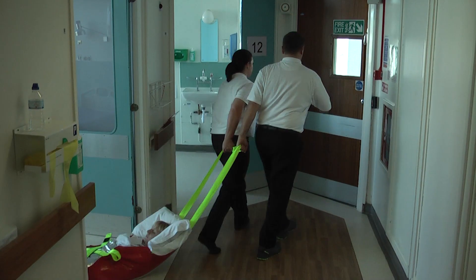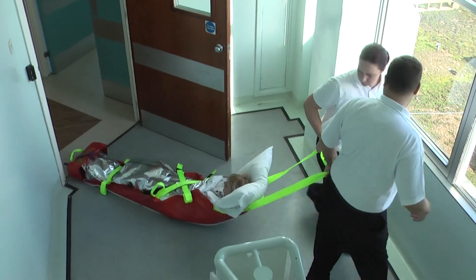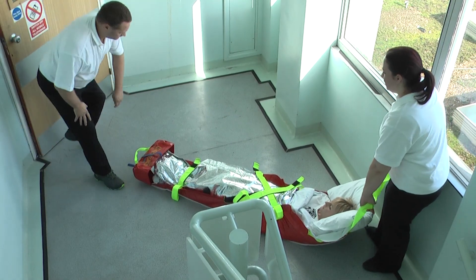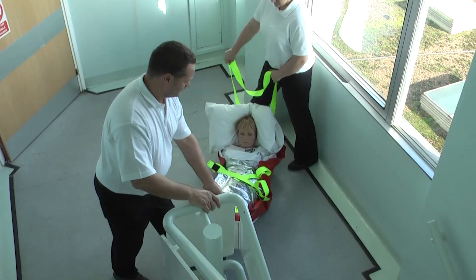Once the ALBAC mat is on the floor, both operators should pull it towards the exit or stairs. It is easiest to pull from the long straps at the head end, especially if doors are to be negotiated. However, it is vital that the user approaches the stairs feet first.